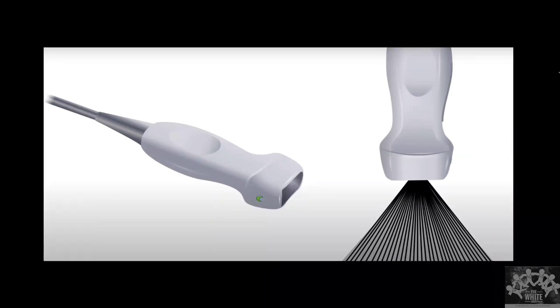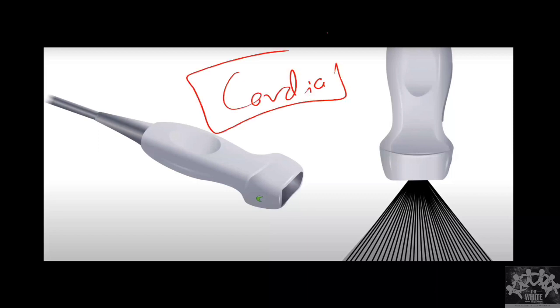In conditions like chest imaging, such as cardiac imaging, we don't have enough space to keep our probe. There is very little space in between the ribs. That's when we use phased array probes or sector probes. This is similar to a linear probe and also to the transvaginal probe. It is very small, but it gives diverging rays. Here, we don't use different crystals; we use electronic control over the crystals so that it diverges the rays from the middle.